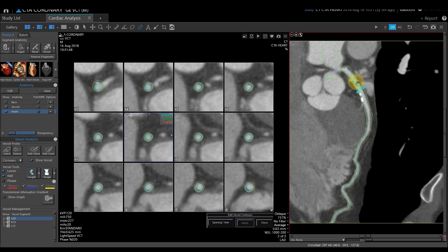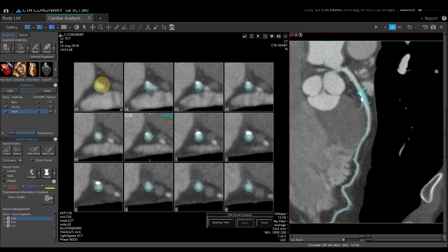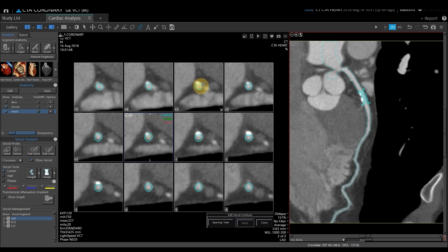I'm going to grab my little slinky and put it near those two calcified sections. If I need to edit my contours, I'll come over to the left-hand side under Vessel Analysis and uncheck the vessel wall because I want to edit the contours of the vessel lumen. I'll come to my first slice that needs to be edited and left-click and draw a new circle. With this particular tool, you do not have to draw on every single slice — you can skip a couple slices, hit Apply, and it will interpolate the ones in between. Once you're happy with your contours, you can hit Close.